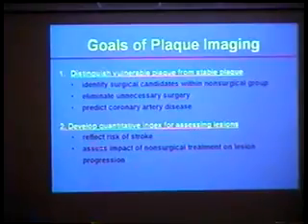So this part is a heavily image-processing-based project, because we believe we have to have a semi-automatic way of looking at this, and we have to be able to generate quantitative information of what we see in MR images, such that the information can be used to follow patients over time to see how this process evolves.